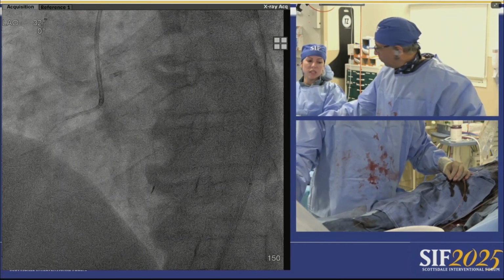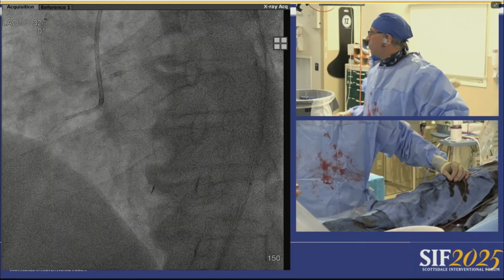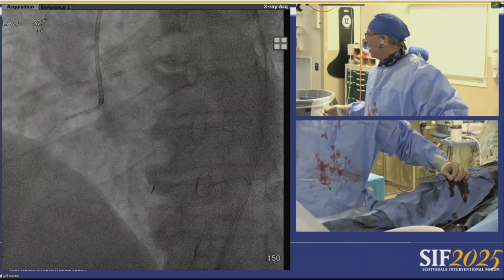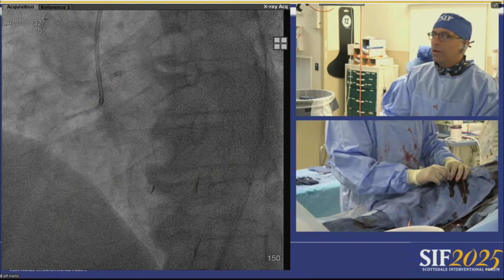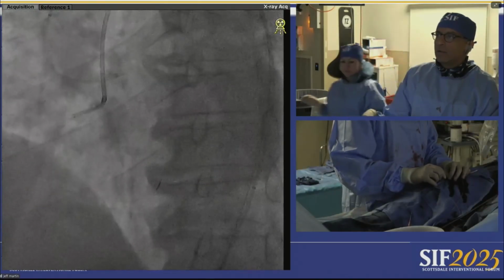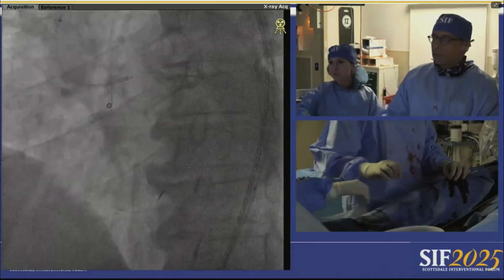But I don't know, man. If it's me and it's close to my bifurcation, I heard BIF this weekend was not the word of choice. That's fine. The bifurcation this weekend, I don't know. I think that DCB might be the way to go. But again, I know that's not data-driven or anything else. Most of what we do isn't data-driven.